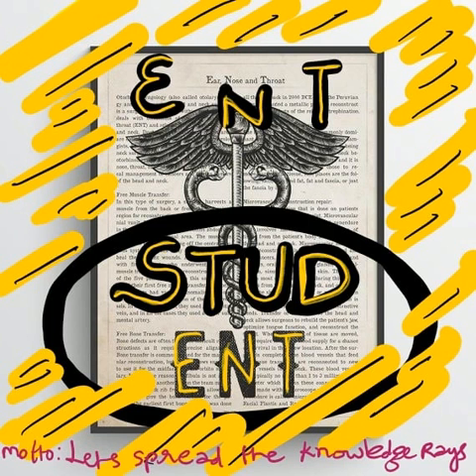So, linea temporalis, spine of Henle and mastoid tip are identified. Drilling is started along the linea temporalis: first cut, second cut, and third cut. Third cut is perpendicular to the first cut and tangential to the second cut.